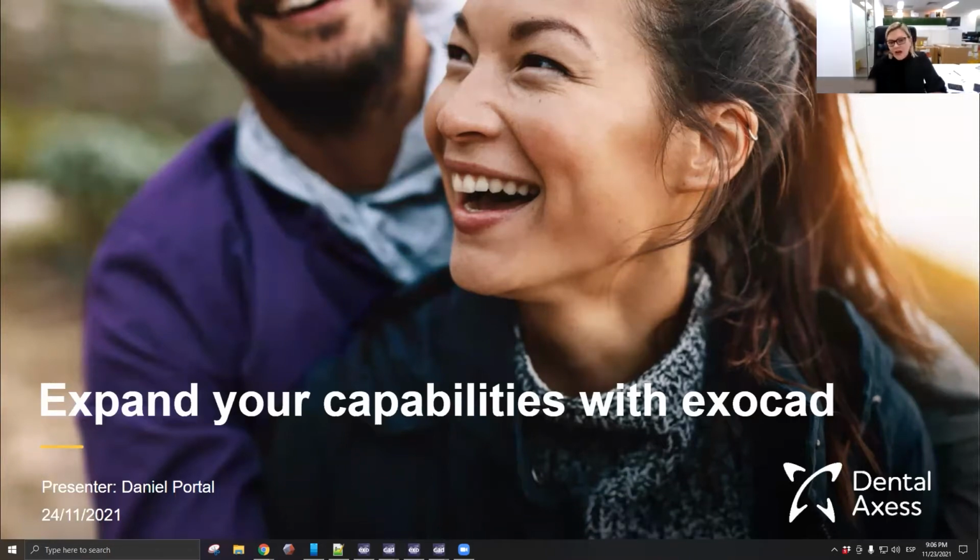So we just felt as exocad gains momentum in this part of the world, certainly great to have Daniel come online and to give us some tips and tricks on the exocad platform. Also talking about some of the workflows that are possible, and definitely looking at some of the new highlights with Galway 3.0.